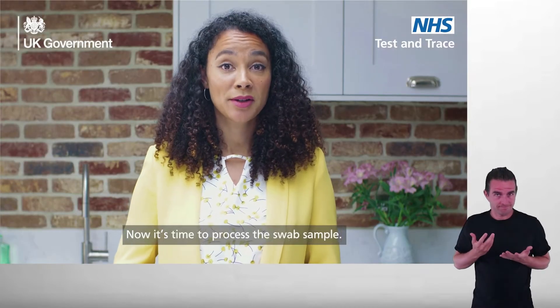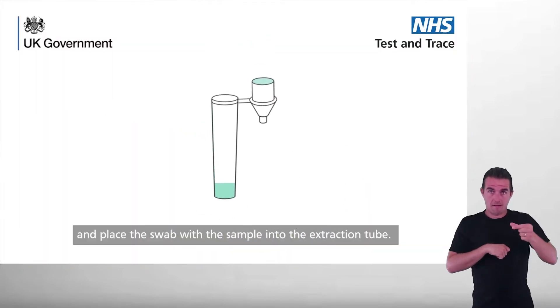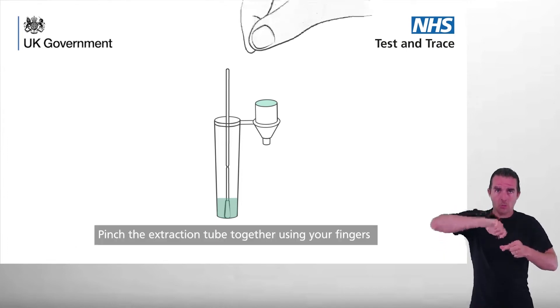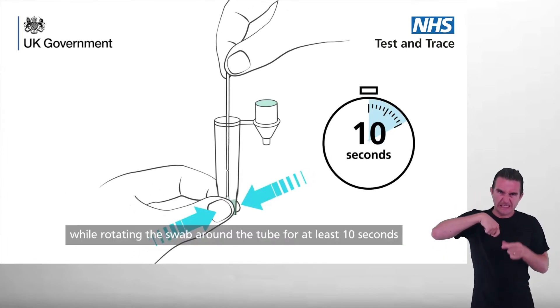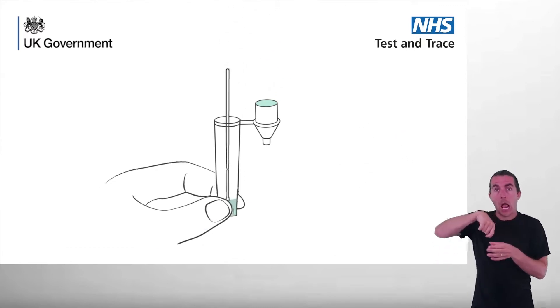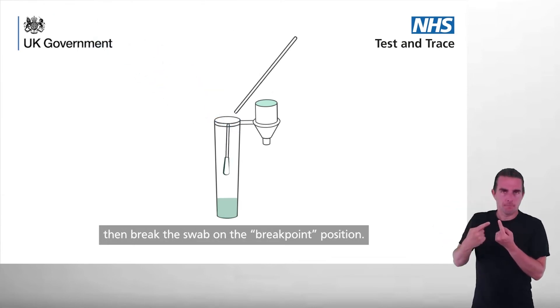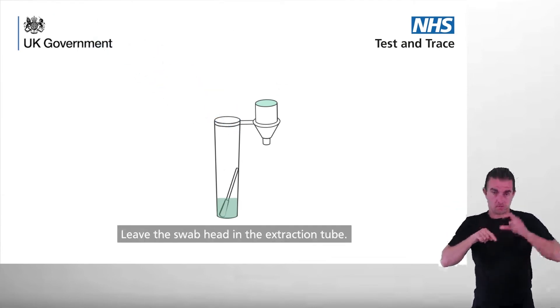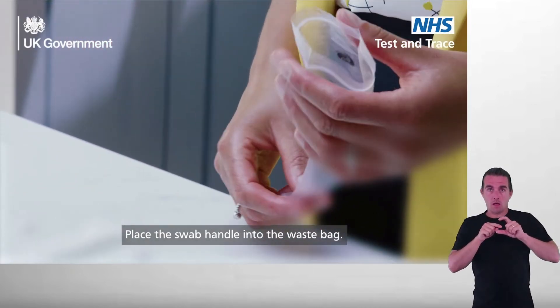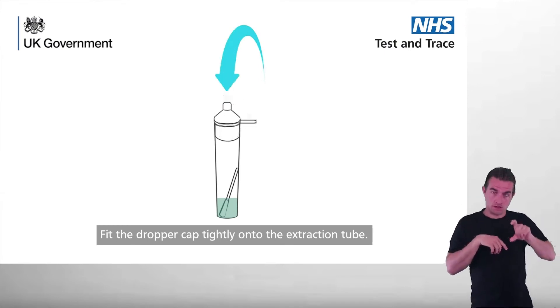Now it's time to process the swab sample. Pick up the extraction tube and place the swab with the sample into the extraction tube. Pinch the extraction tube together using your fingers while rotating the swab around the tube for at least 10 seconds. Slightly lift the nasal swab then break the swab on the break point position. Leave the swab head in the extraction tube. Place the swab handle into the waste bag. Fit the dropper cap tightly onto the extraction tube.